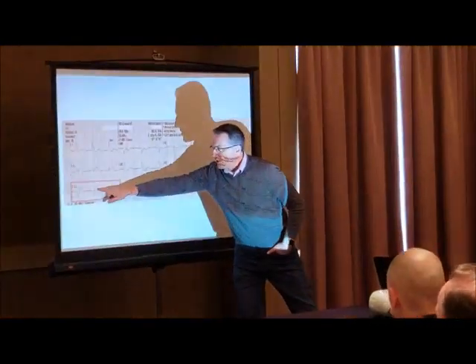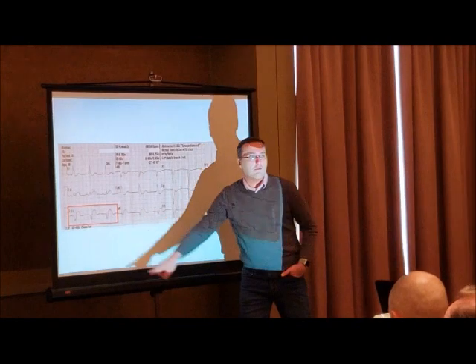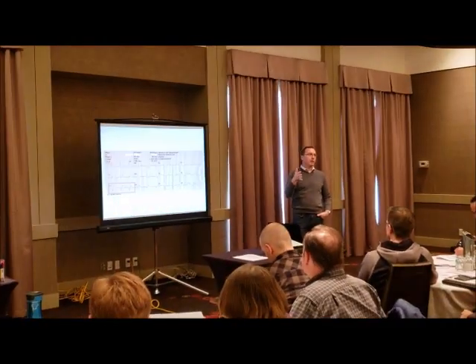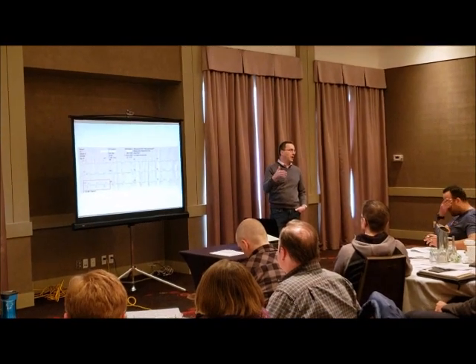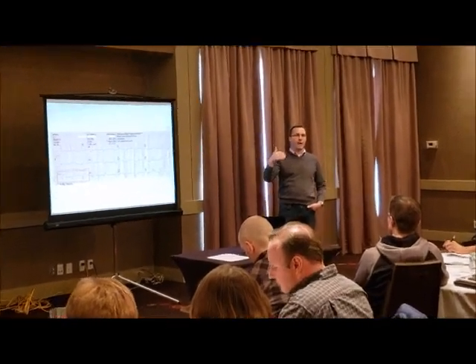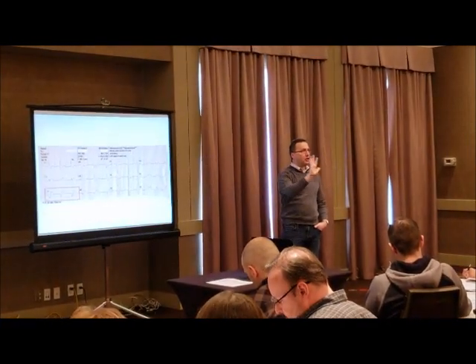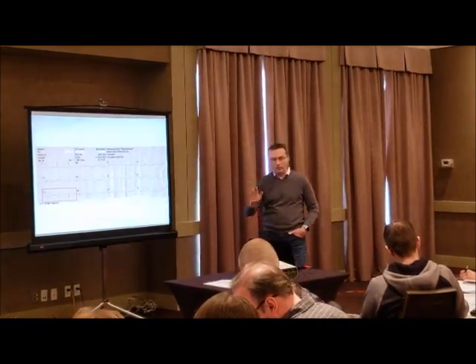How many millimeters of ST elevation there? We have almost 5, like 4.5, 5. Is that greater than 2? Yes. That is how you can adapt Smith's modification for field use. Count the number of large blocks of S-wave depth, and that is how many millimeters of ST elevation you should allow in that lead for left bundle branch block.